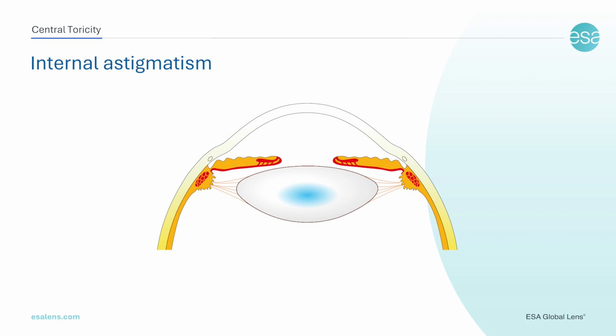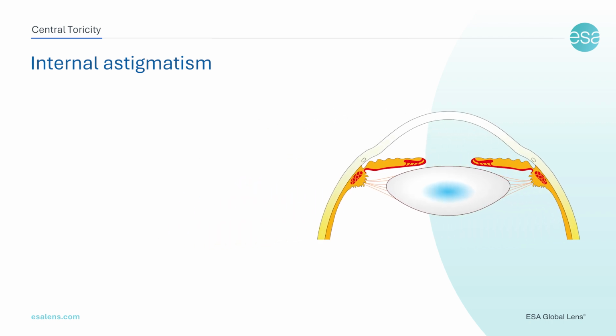As previously noted, dual toric lenses can be utilized to correct internal astigmatism, but this is clinically viable in only one specific scenario. To achieve this, 2 critical conditions must be met simultaneously. 1. Toric periphery. The cornea must possess sufficient peripheral toricity, 3/4 of a diopter, and the patient must be fitted with a correctly sized and aligned peritoric lens. 2.